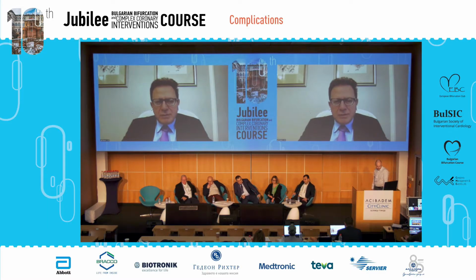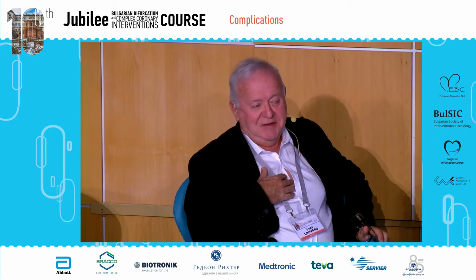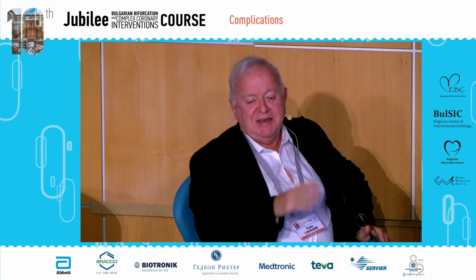May I have a provocative question? What about intravascular imaging? Does it help, and how much can it help? You know, this problem was created by too much proximity between a guiding catheter and a small vessel. Personally, I would avoid putting anything else in the vessel.